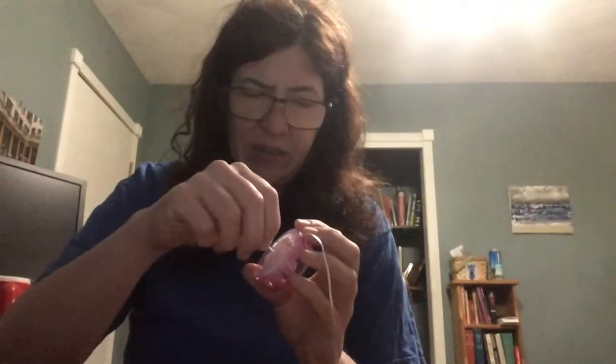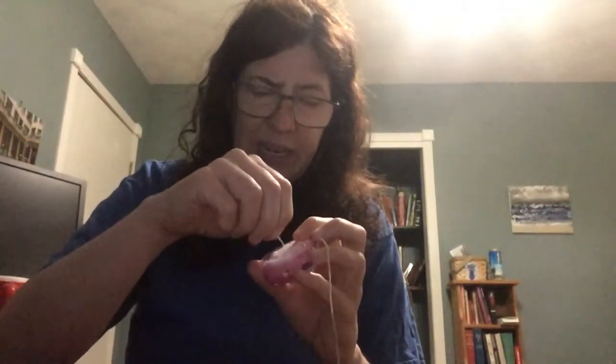And then take the cap off very carefully, because if this thing bends, it'll go in bent, and that's the last thing you want. That will cause kinked cannulas, which are not fun. I'm going to go ahead and put this on the right side of my abdomen. I have a little spot right there that hasn't been used yet.